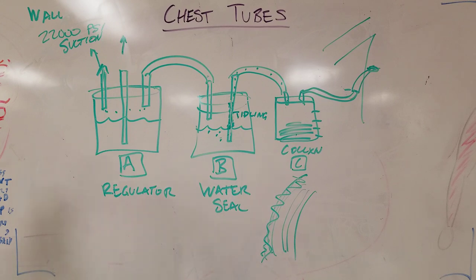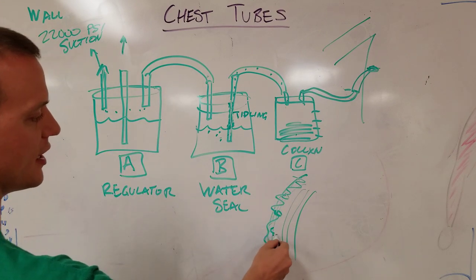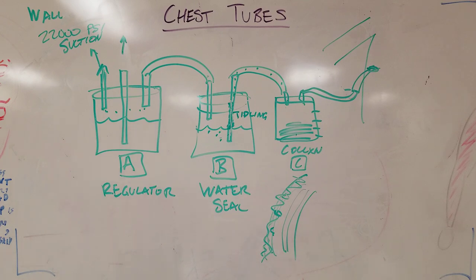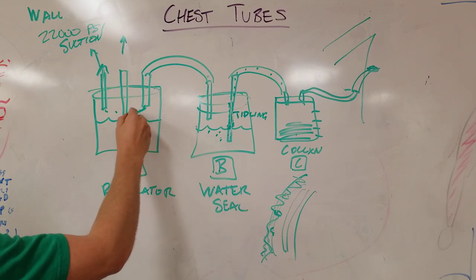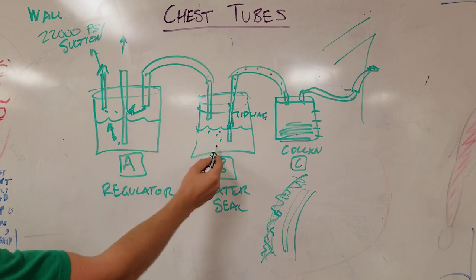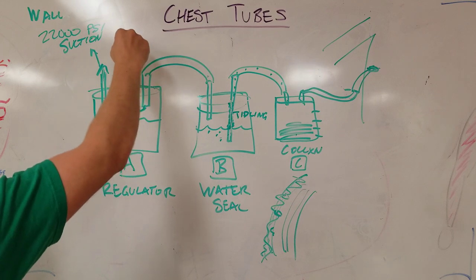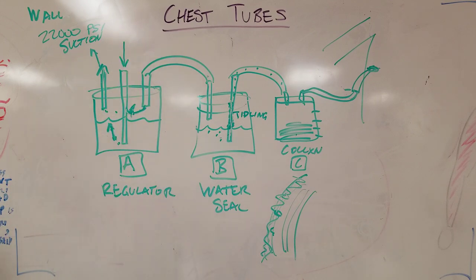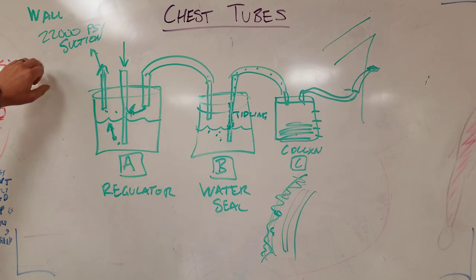And at that point in time, to prevent the wall suction from sucking on this lung and sucking into the chest tube and hurting it, we're gonna have a pop-off regulator, and that's where this last pipette comes in, okay? So at some point, once the lung is reopposed, the suction will, instead of taking air from here, take the air from here. That's the same concept as the whole blowing bubbles with a straw thing that I talked about earlier. So at some point, atmospheric air is gonna be coming in, so instead of the suction seeing the lung, or the lung seeing the suction, I should say, this outside air is gonna see the suction.